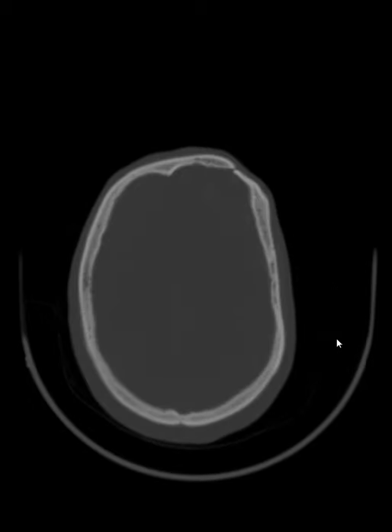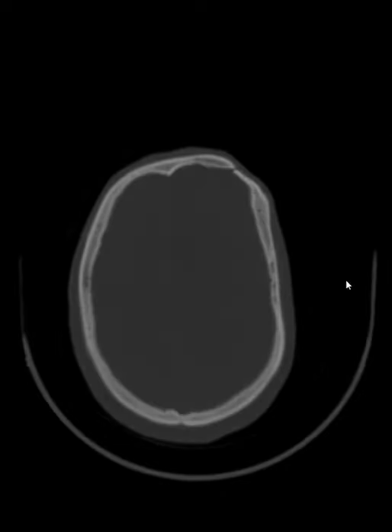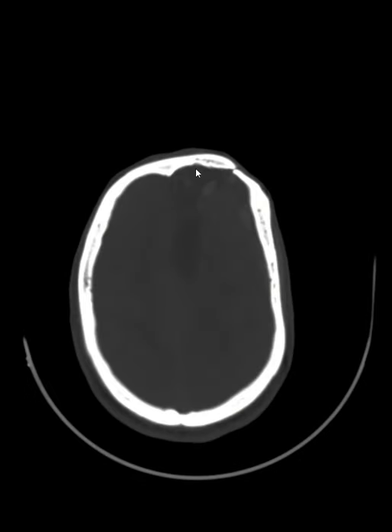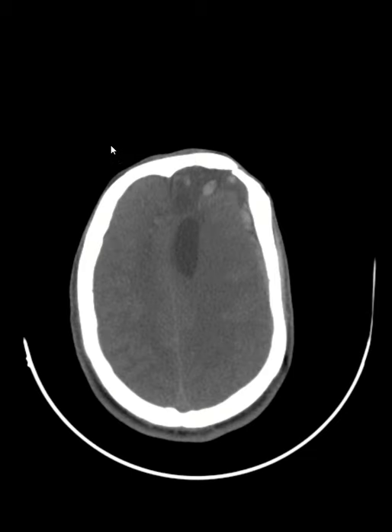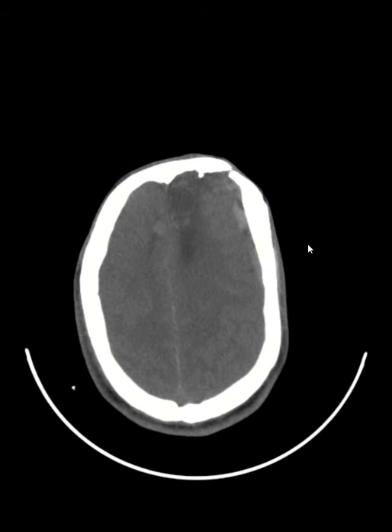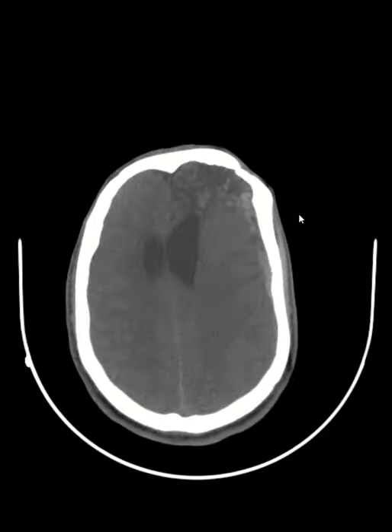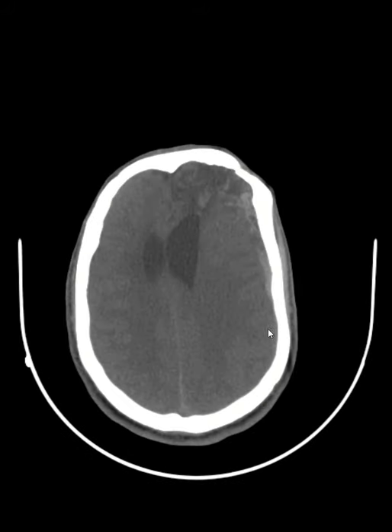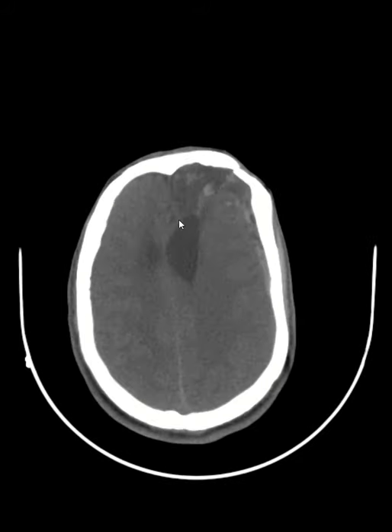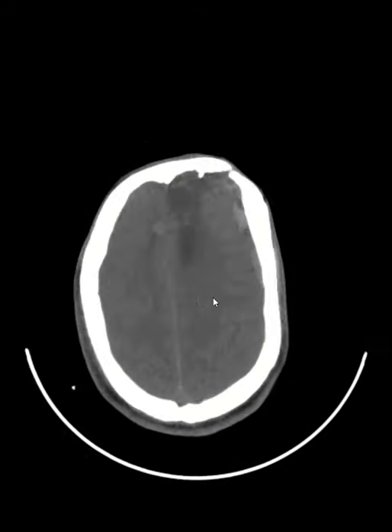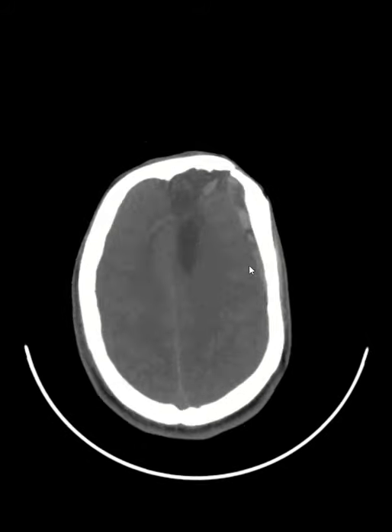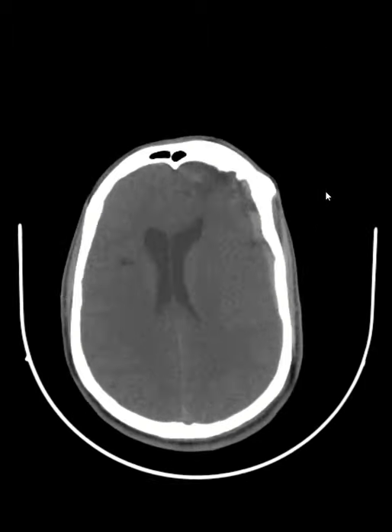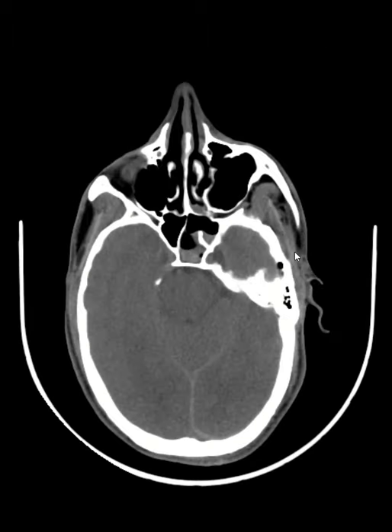There is a history of trauma in this case. As you can see, there is a left frontal contusion. At the same time, there is a subdural hemorrhage. As you go down, there is dilatation of the left side frontal horn or ventricle.